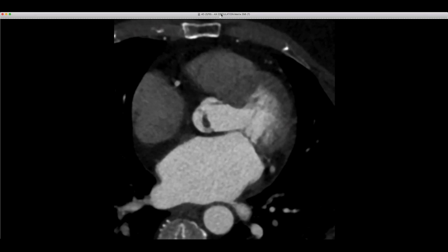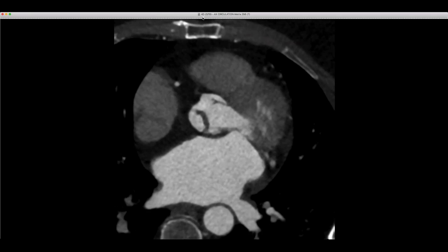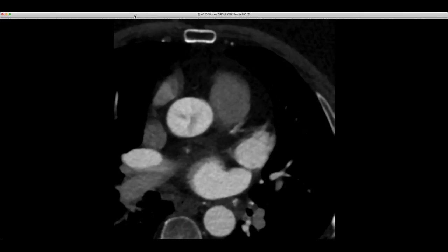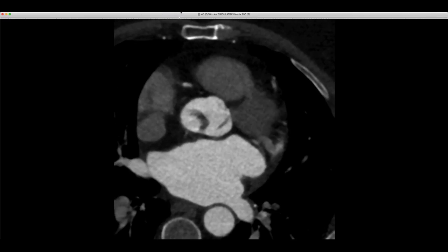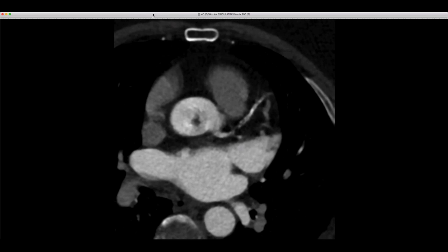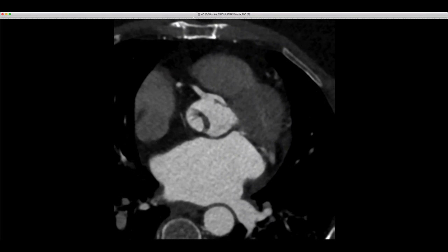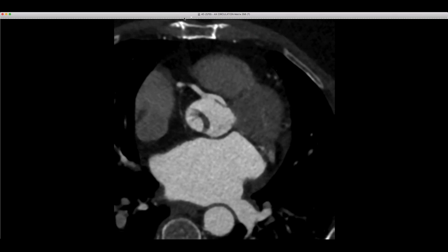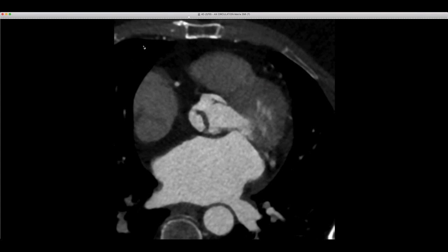One of the aortic valve leaflets closest to the non-coronary sinus is really thickened here. The question was: what was this? Was this going to be a fibroelastoma? I've never seen one so large and linear like this. Was this going to be a thrombus? Was this going to be a vegetation? She wasn't symptomatic — no sepsis, no embolic symptoms, no stroke.